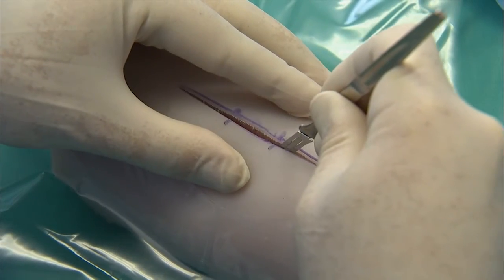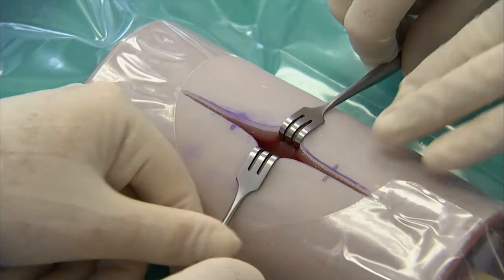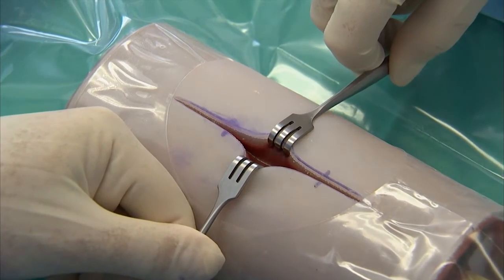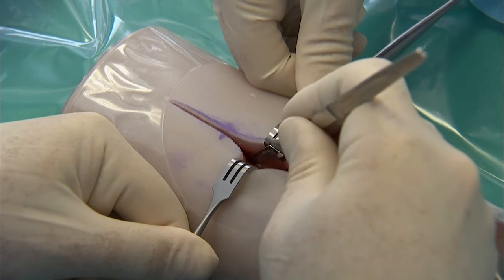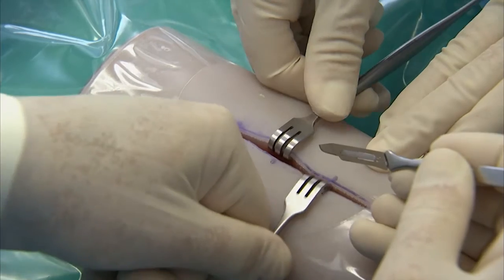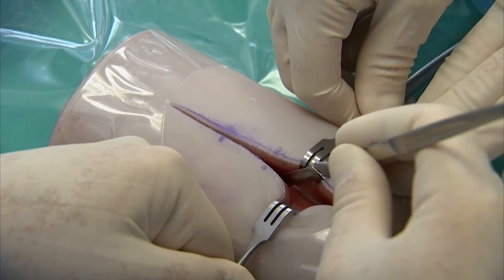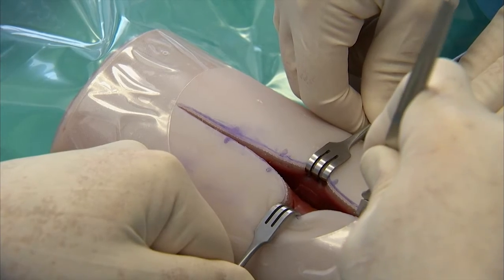Proceed with deepening the incision. Ask your surgical assistant to help you by retracting the wound margins. The retractor should be placed on the opposing sides of the surgical wound, and the assistant should retract with the intention of opening the wound for proper visualization of the operative site. Retract within reasonable limits. Do not retract so hard as to tear the tissue.